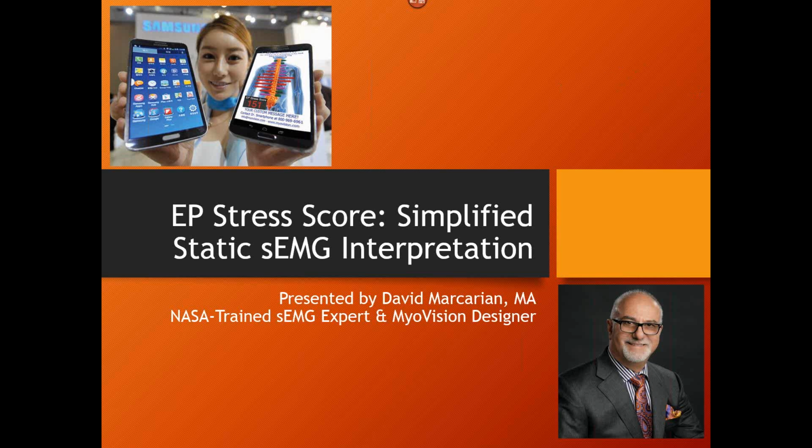This is David Marcarian, the inventor of the MyoVision, and I'm here to talk to you about the EP stress score. It's a kind of a cool way of looking at static surface EMG. It makes it extremely simple to understand. I'm going to go through it relatively quickly. If you have any questions, you can ask. It stands for electrophysiological stress score.